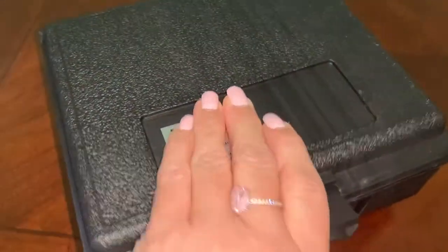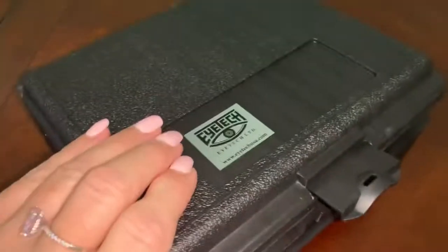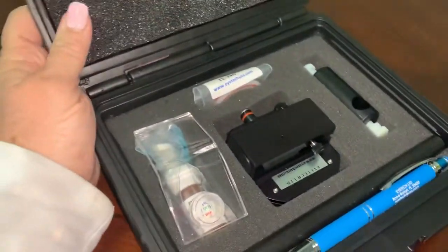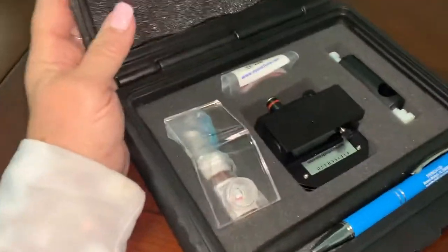Each of my clinical trainers has a couple of these, and so do I. Let me just show you what comes in it — I just got a brand new eye model, and these are fantastic.